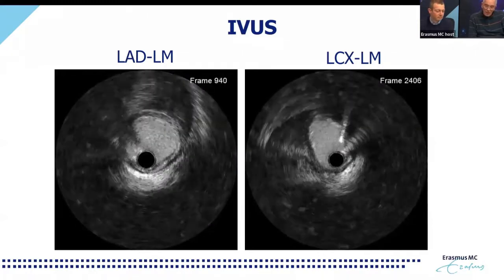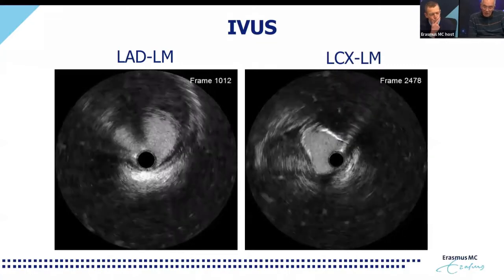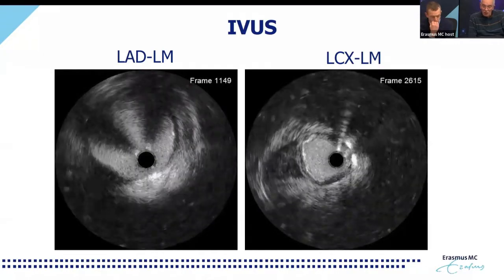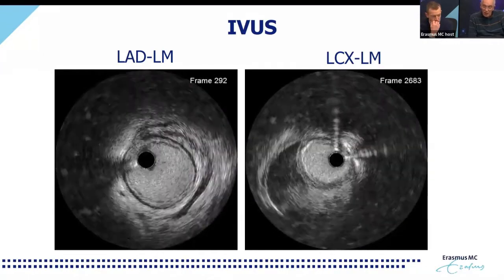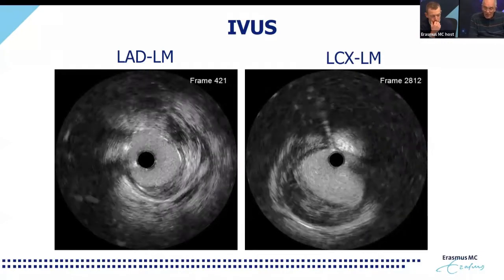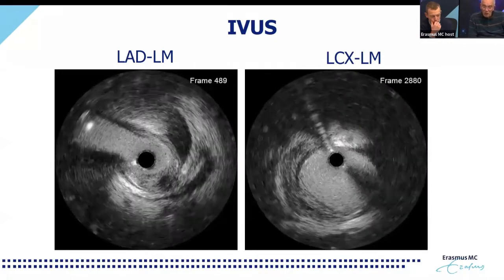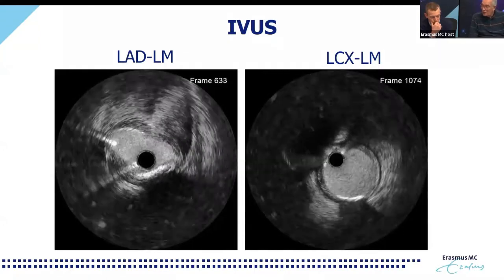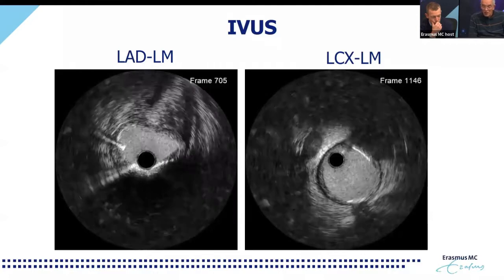At the moment that you close, if such happens by accident in one of your procedures, you can see the same thing. The moment that you close the opening, then you see that the adventitia is coming back. And that's why it's also very important that if you would place a stent in here, you never size on the outside of your adventitia, because that's not realistic.